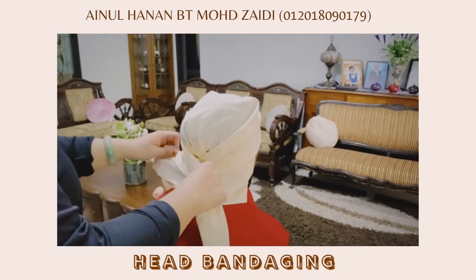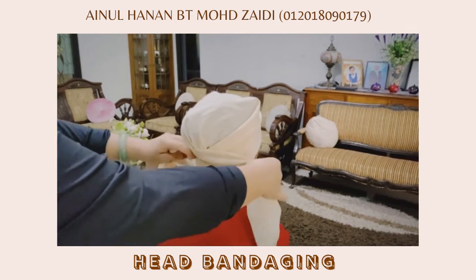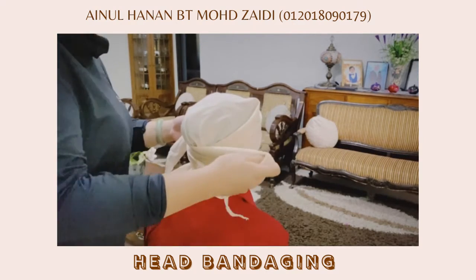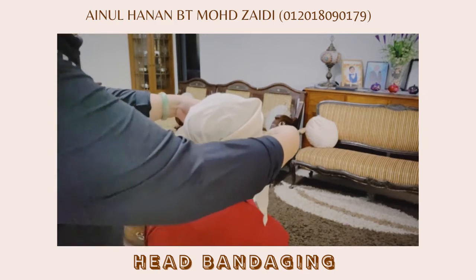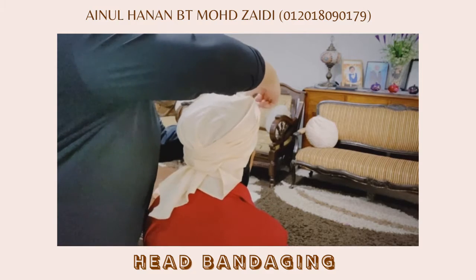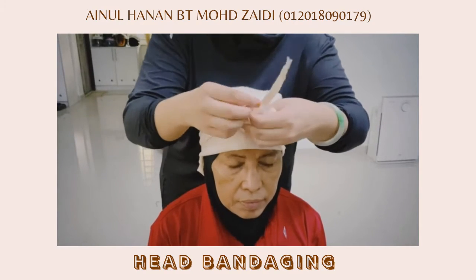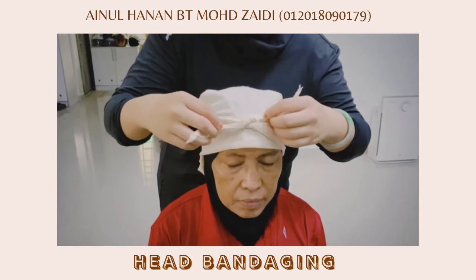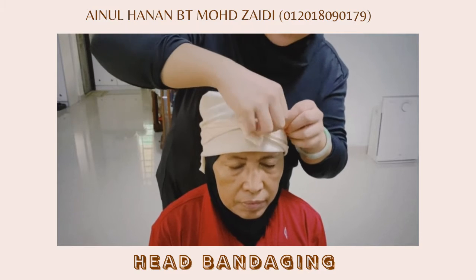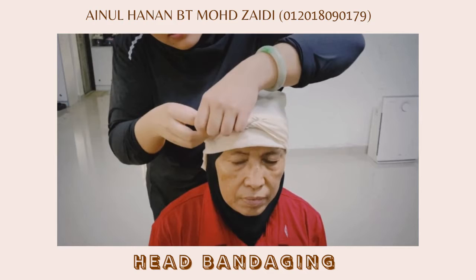And then you have to cross behind here, like this. And then bring these two ends to the front. Once you bring the two ends to the front, tie the other two ends here and then tuck it in and make sure that it is secured, like this.